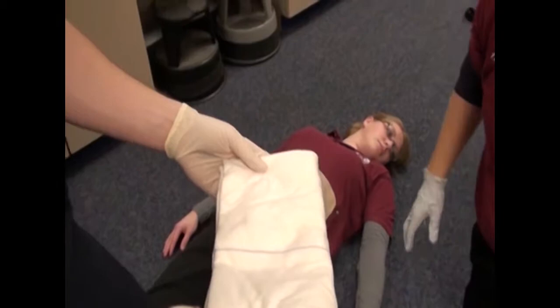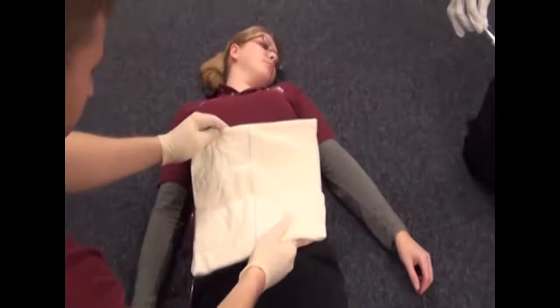Covers abdominal organs with sterile dressing soaked in sterile saline. Just leave it folded and tip it upside down.